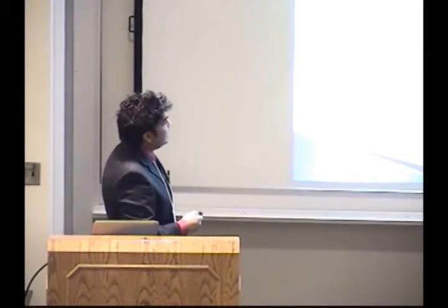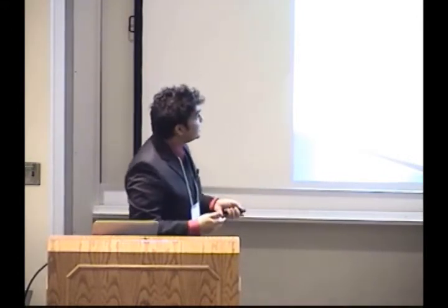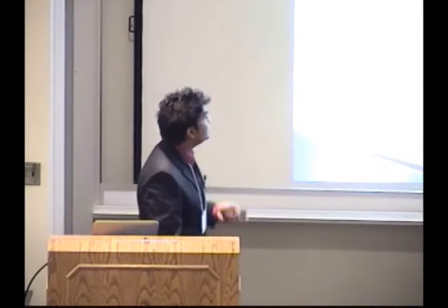Another thing that we've done differently is that, for instance, with the LED stimulation box, the LEDs are always in the same fixed positions. But on our checkerboard, we light up the possible moves that you can make in the game. So the positions of the stimuli are always changing in an intuitive way: you look at the square that you want to pick up the piece from or place it at. And finally, because the signal-to-noise ratio in this signal is so high, we don't need training in the algorithm that we implemented. We just applied a simple threshold, and it works fairly well across different subjects.